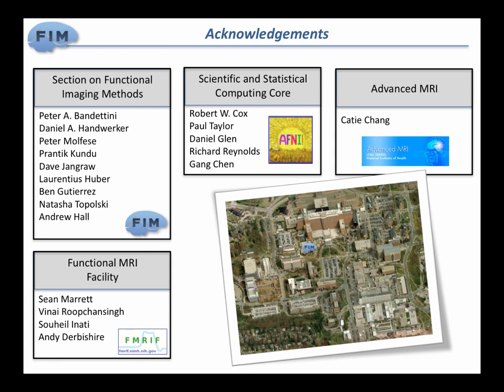Does this give you a censor list that you can use in your regression? Does MEICA provide that? Not that I know of. Maybe the latest version includes something like that. I mean, maybe I'm wrong here, but you're removing components as a whole. It's not like you're censoring parts of a time series, a whole time series goes out or doesn't. But maybe the new version does some combination of things that I'm not aware of. No, not that I am aware of.